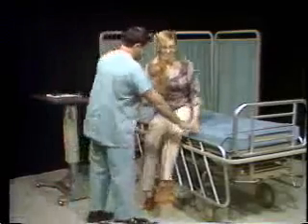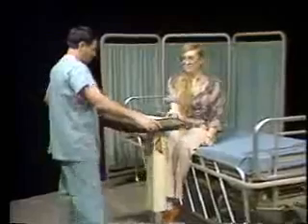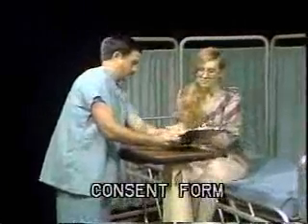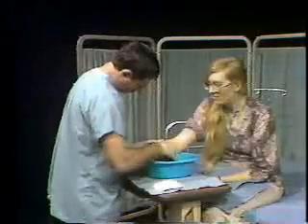Preparing the patient for suturing is part of the nurse's responsibility. The patient should be made as comfortable as possible. The patient or guardian must sign a consent form. The physician first inspects the wound in the emergency room in preparation for suturing. Individuals other than the physician cannot suture the face, palms of the hand, or soles of the feet.